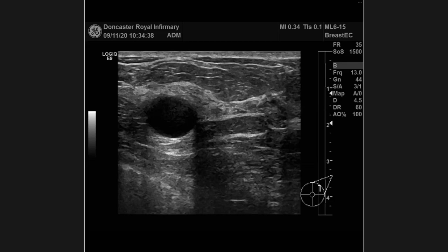Yeah, that's wonderful. So that's exactly what we would do. Your presentation of the mammogram and ultrasound were very good, very clear, and your management plan was good. Often in the UK, we offer them aspiration for symptomatic relief. Okay, aspiration. That's patient choice. If patient wants it aspirating, we'll aspirate it for them, but there's no requirement to do that. Okay, yeah, that's wonderful. Thank you.